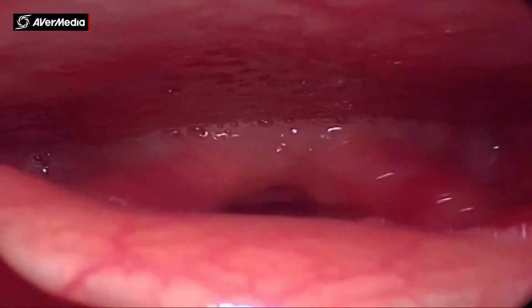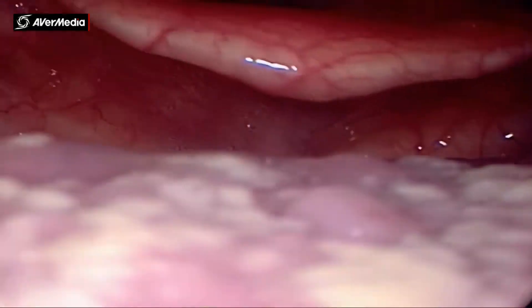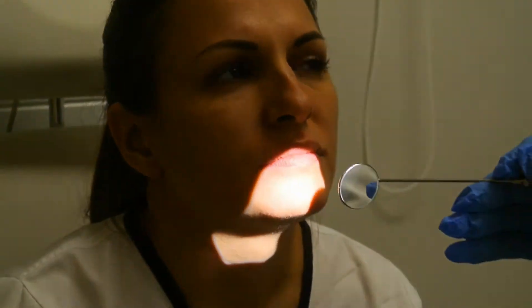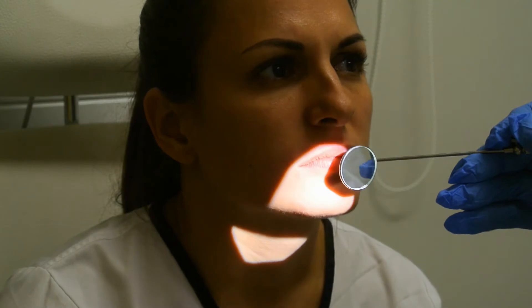Phonation causes the vocal cords to close, whereas breathing or inhaling would open up the vocal cords. So while doing this we can observe the movement or mobility of the cords on both sides. At the same time we will check the rest of the larynx and hypopharynx.